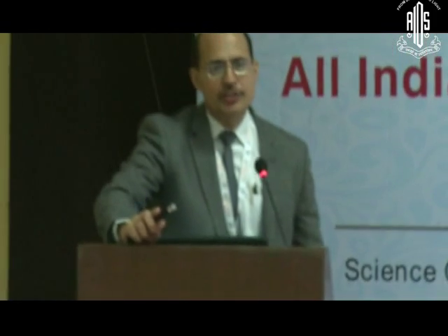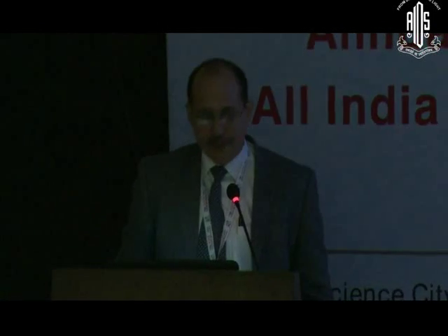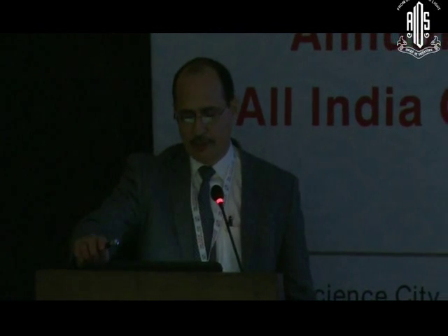I'll be talking about optic disc findings in glaucoma basically, and optic disc evaluation in glaucoma is very critical, and even if you have all the investigations, still a good examination is actually fundamental to diagnosis of glaucoma and its management. And very often this is the first place where you actually suspect that a person may have glaucoma, because other methods like IOP are not very reliable in diagnosing glaucoma.